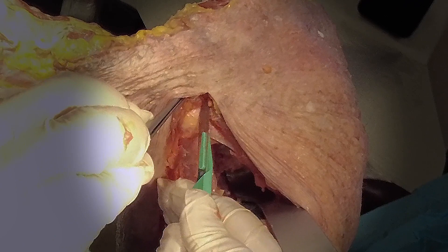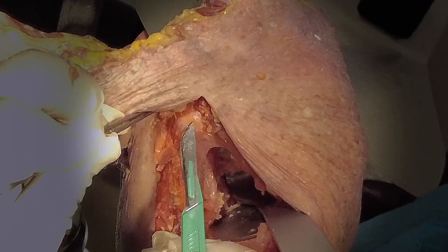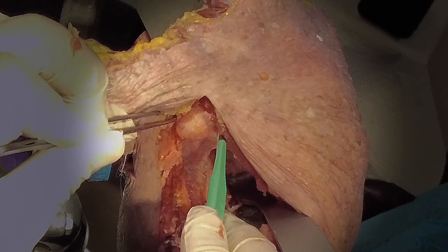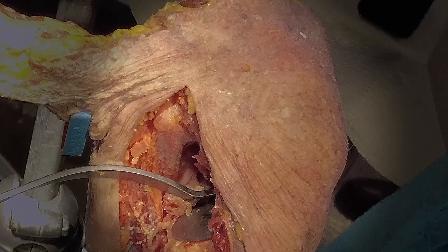I typically don't remove the tendinous portion of the conjoint tendon over the coracoid, although many do with a bovie to expose the bone — I don't think that's necessary for this technique. Once the coracoid is exposed, we get retractors in place to help with visualization during coracoid block placement. I also release the posterior retractor to prevent tension on the axillary nerve while doing the coracoid block.